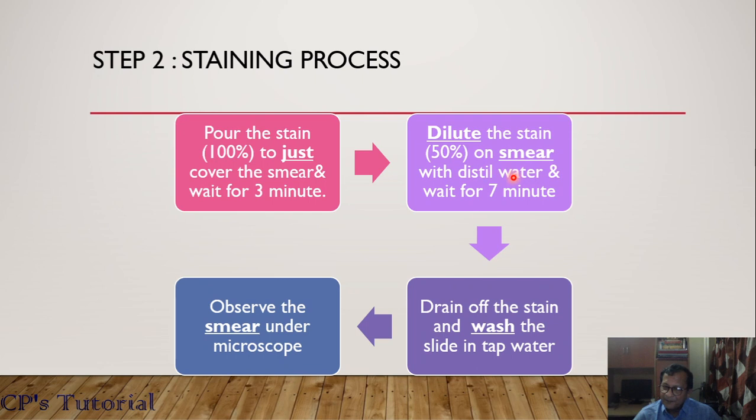After that, you take it, drain the stain from the slide, and then wash it. During washing, you should be careful that it is kept vertically under the slow flowing of the tap water.